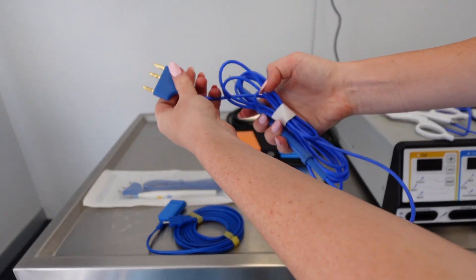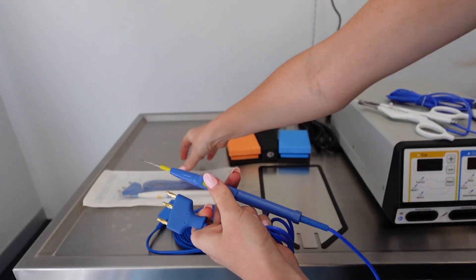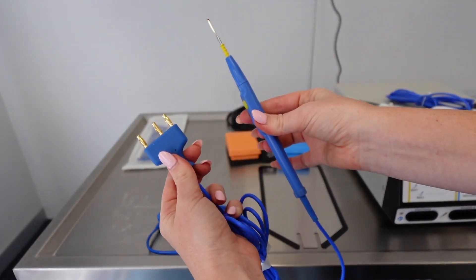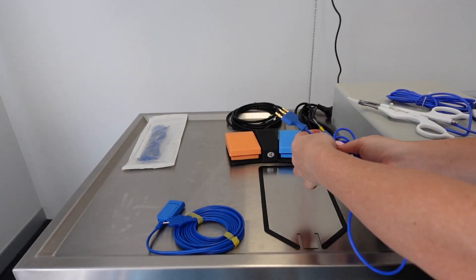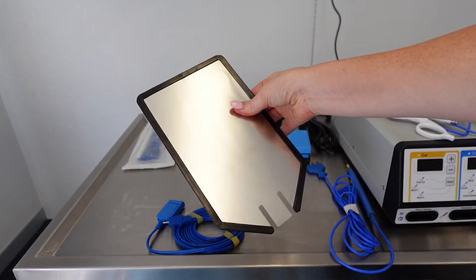This second attachment is your cutting piece, or your monopolar attachment — this is how they'll usually come. They are autoclavable. You might have an autoclavable removable tip or you may be able to autoclave the whole thing — just check your instructions first.